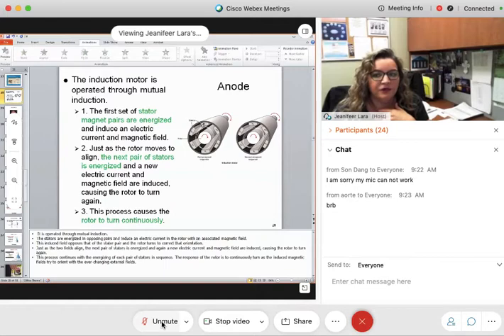It's electrifying the magnets and removing the others. Not all of them are electrified at the same time. They are electrified in sequence so the iron can follow it. Yes? Perfect. Good. My little magnet face helped you.